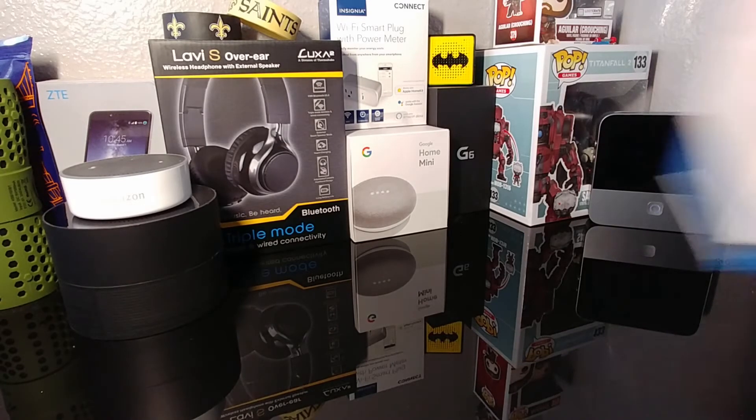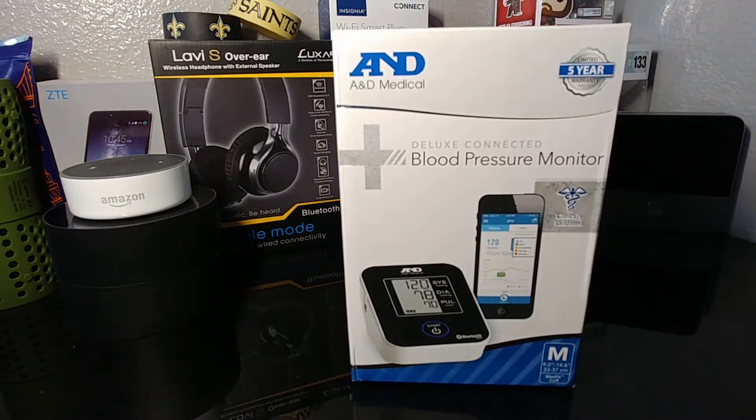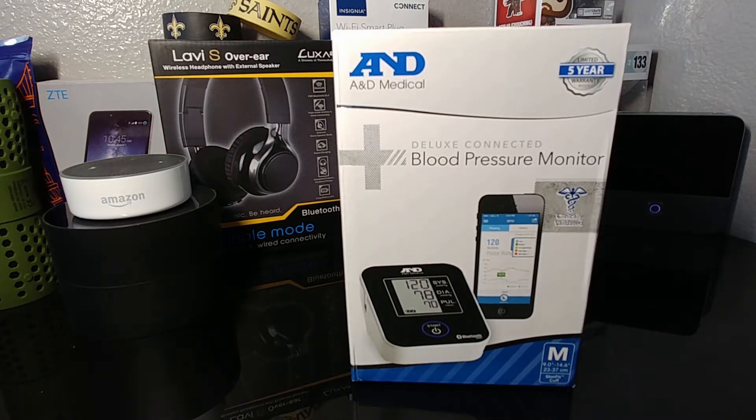Without further ado, let's go ahead and do an unboxing of the A&D Medical blood pressure monitor. This is the deluxe connected version, it has a five-year warranty, and let's just go ahead and get into it.